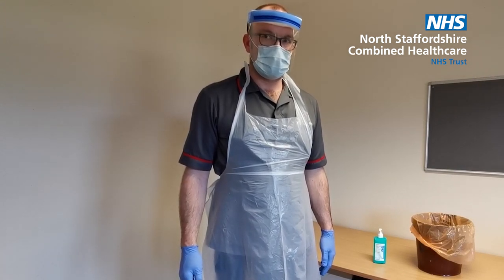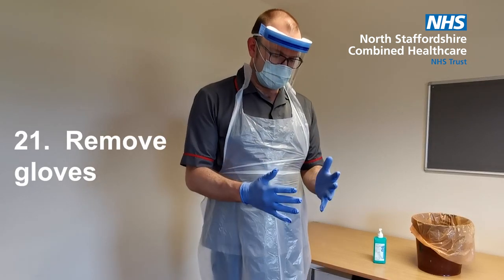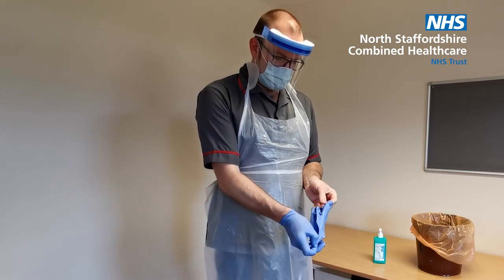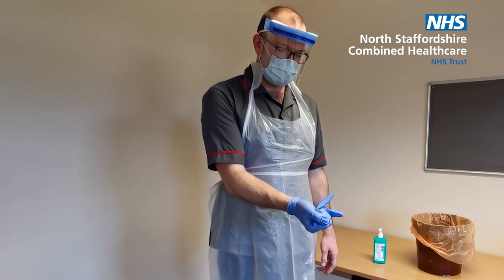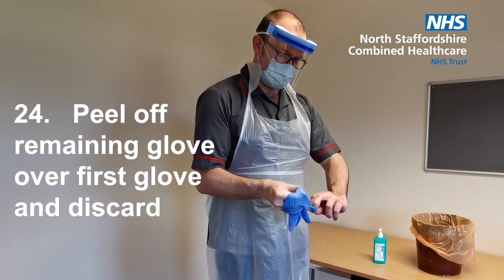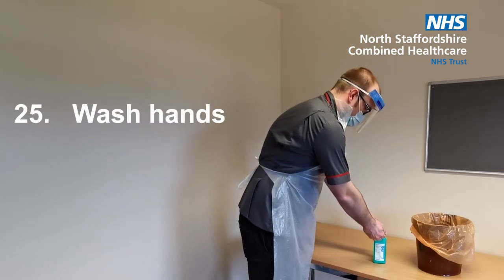So now we come to taking off your PPE. This is known as doffing. First of all, remove your gloves. Grasp the outside of the glove with the opposite gloved hand and peel off. Hold the removed glove in the remaining gloved hand. Then slide the fingers of the ungloved hand under the remaining glove at the wrist and peel the remaining glove off over the first glove and discard. Now wash your hands.